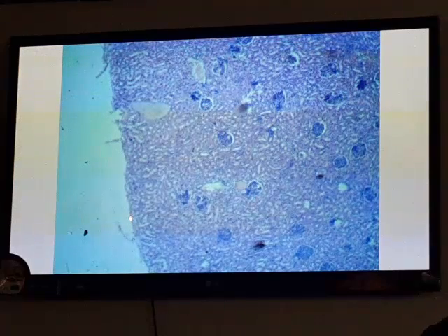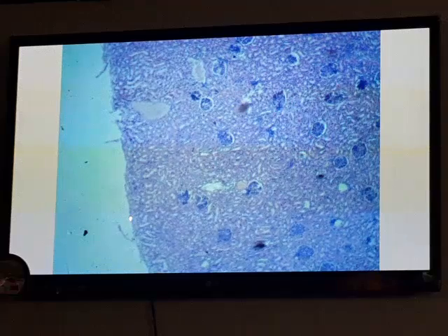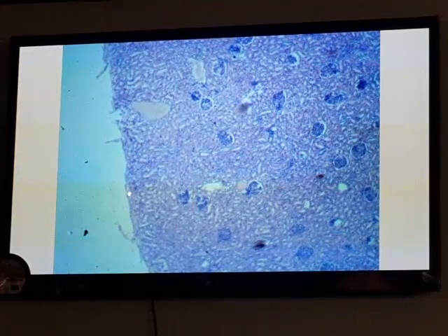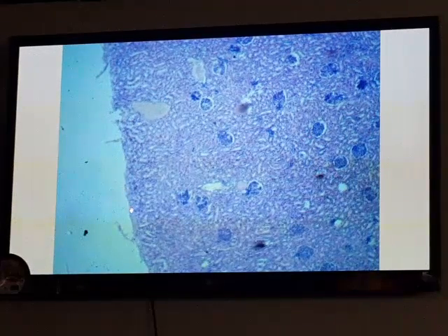In this lab, we will examine the renal system. First slide is a section in the kidney. Each kidney is covered by a connective tissue capsule. This is the connective tissue capsule.